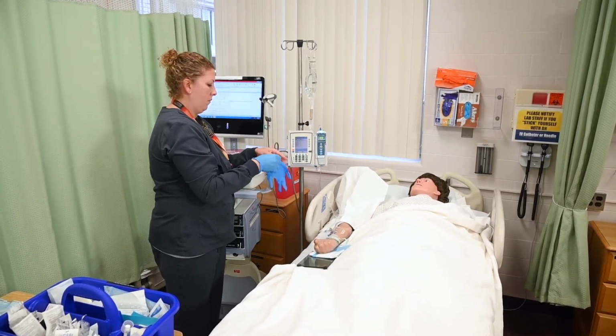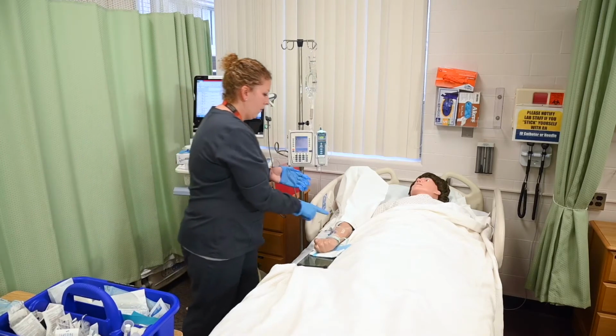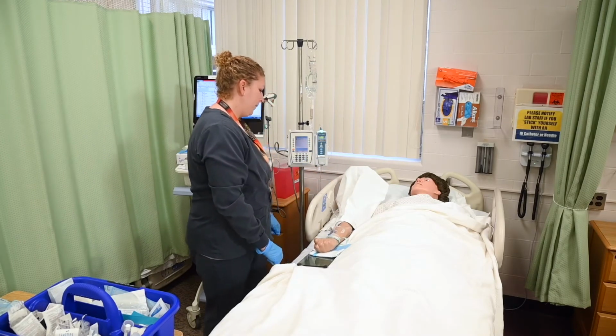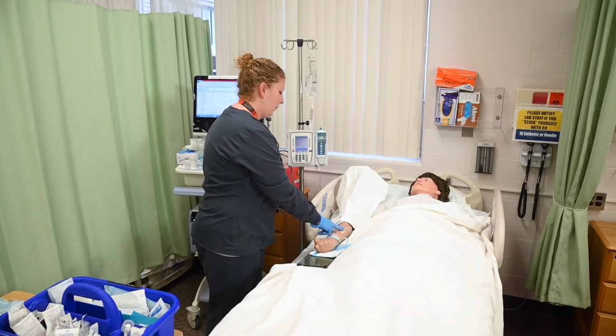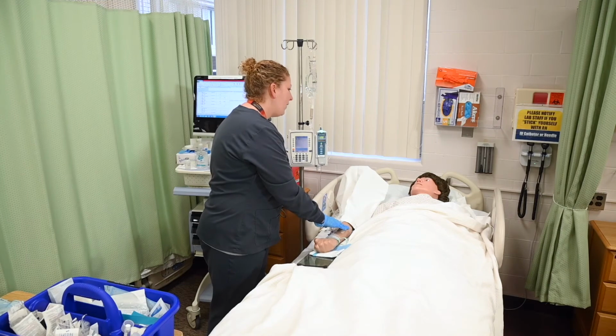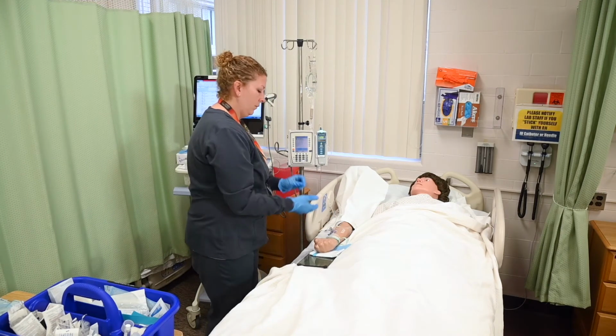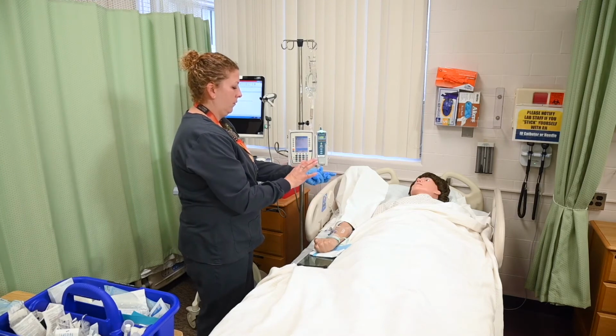Assess the site for any signs of phlebitis or infiltration. Encourage the patient to report any signs of IV site discomfort. Do you have any pain at your IV site, Ivy? Great. Remove gloves, perform hand hygiene, and apply clean gloves.